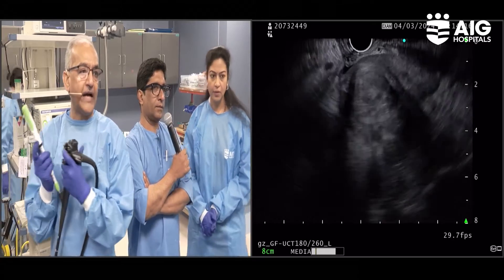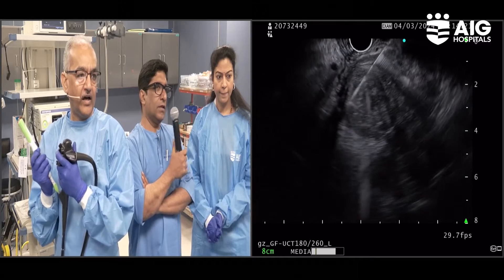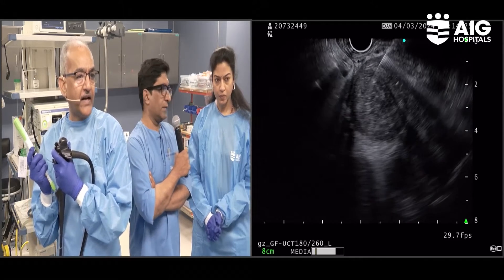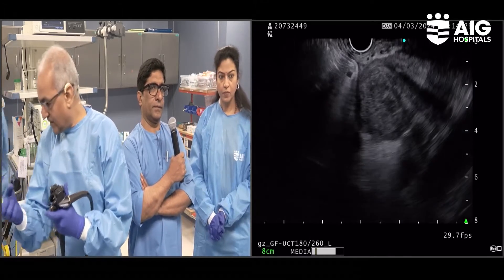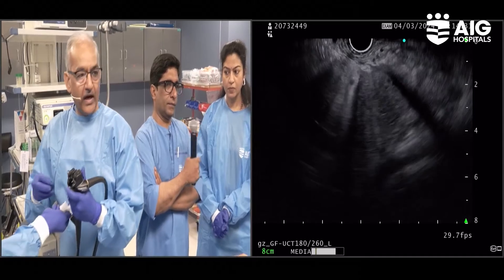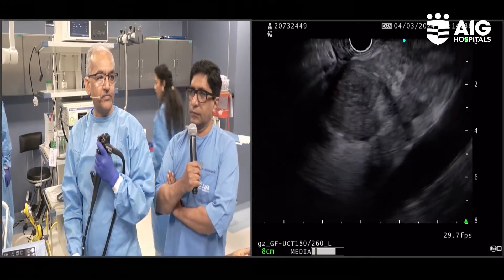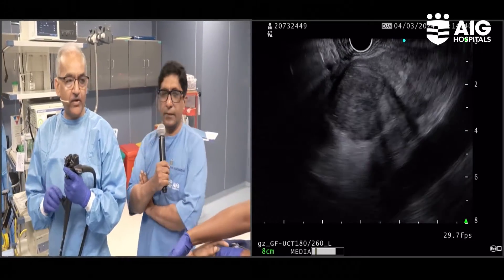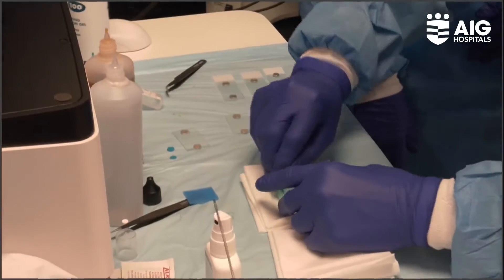I will take three to four actuations in different directions with the needle. This is not ROSE for cytology, but it will be like a whole biopsy — architecture along with the cells both together. I have not yet taken the tissue; there should be a pure white core. I did not apply suction — it was just a stylet removal, the slow pull-through technique.